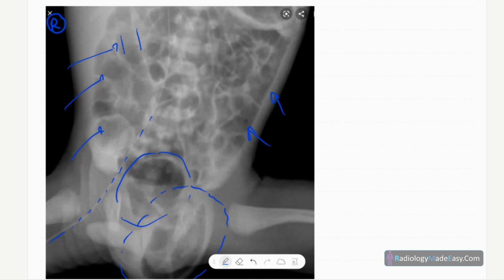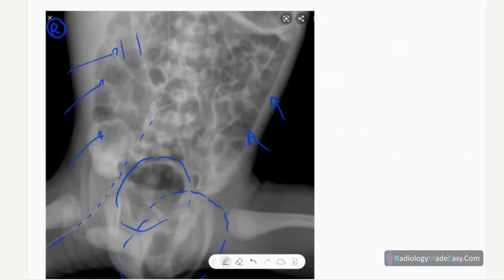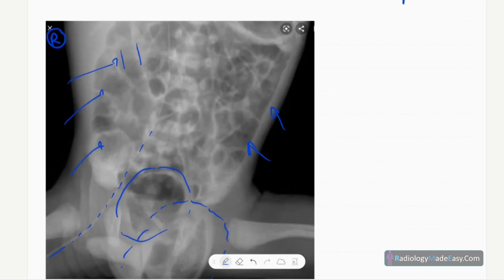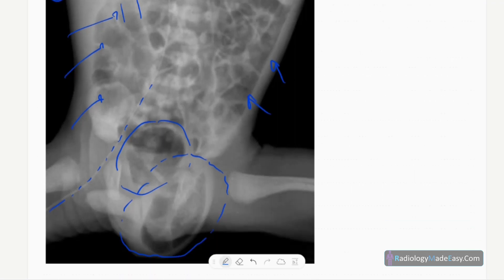You also have to look for complications of bowel obstruction, such as pneumatosis intestinalis, pneumoperitoneum, and portal venous gas. In the erect position, you can see whether there is gas under the diaphragm or a continuous diaphragm sign. In the supine position, you can see the football sign in the abdomen.